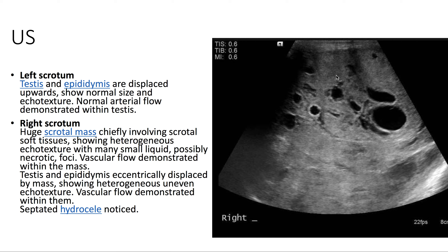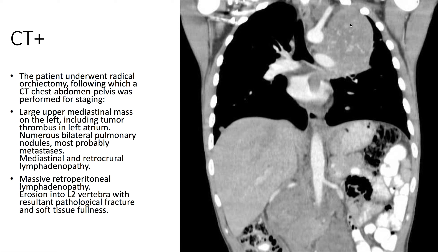The patient underwent radical orchiectomy, following which a CT of the chest, abdomen, and pelvis with contrast was performed for staging. We see a large upper mediastinal mass on the left, including a tumor thrombus in the left atrium.